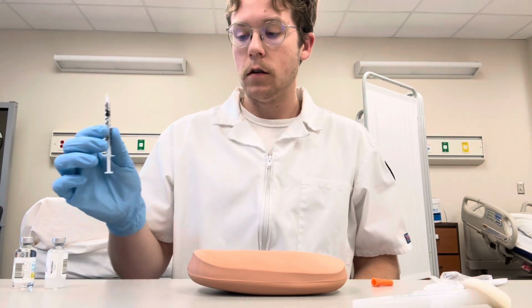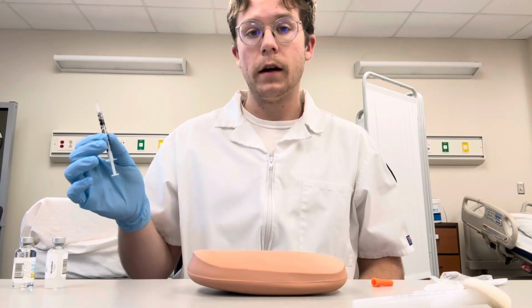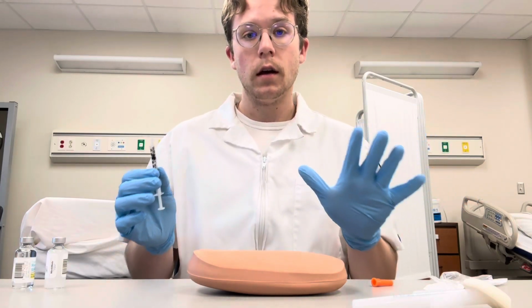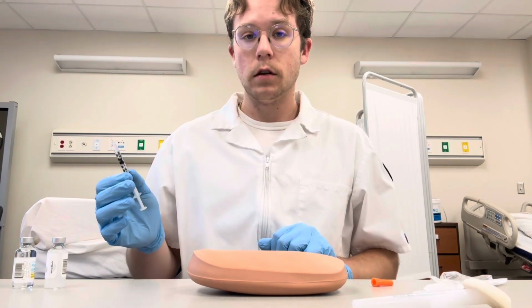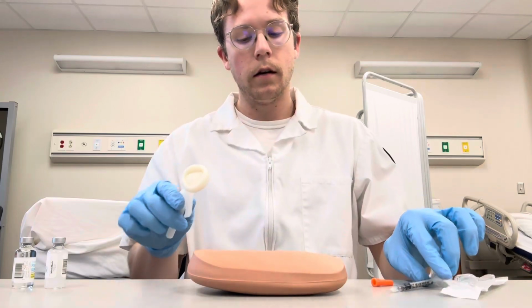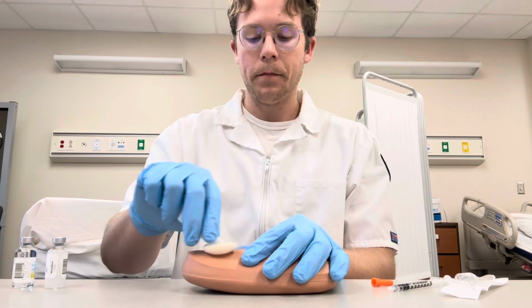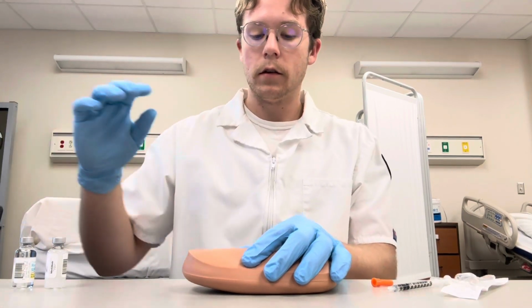All right, so then we will go inside the patient's room and perform our third and final check at the bedside, confirming patient, dosage, medication, and with the MAR and orders. Explain the procedure to the patient, and then we will clean our area, the right abdomen, with an alcohol wipe. All right. Clean 30 seconds.